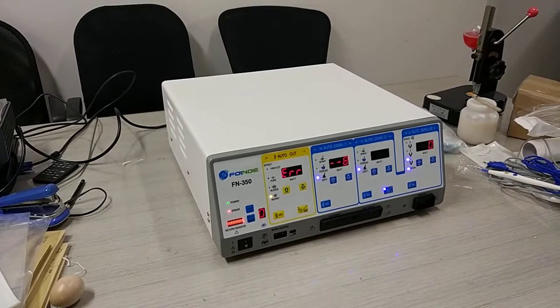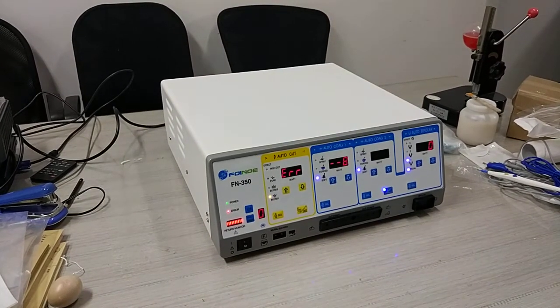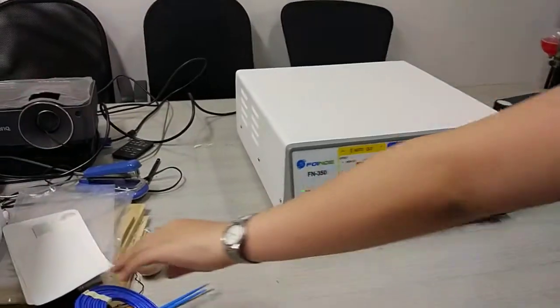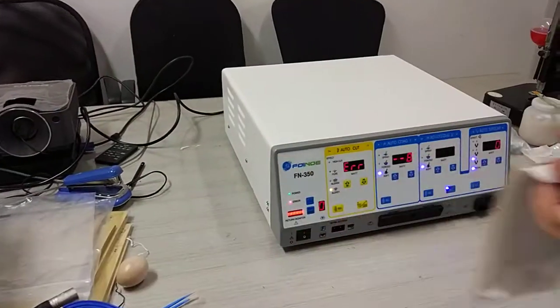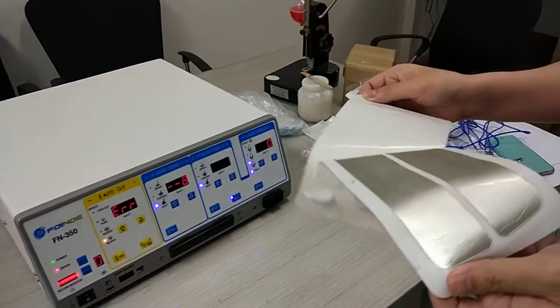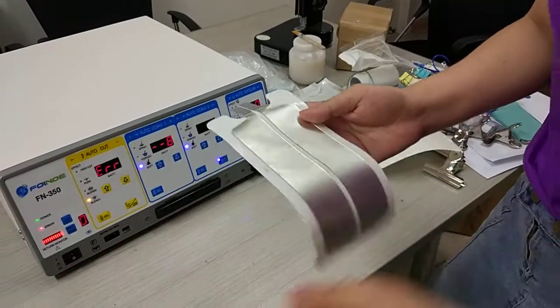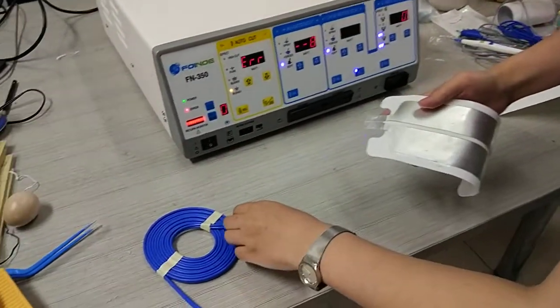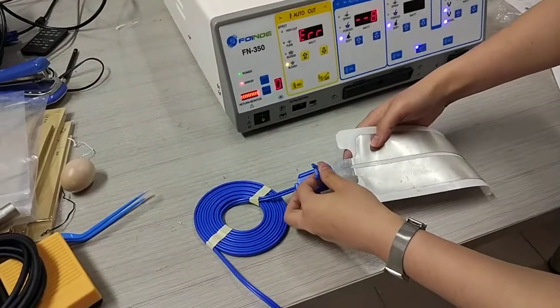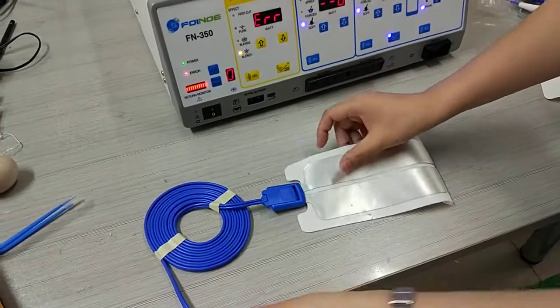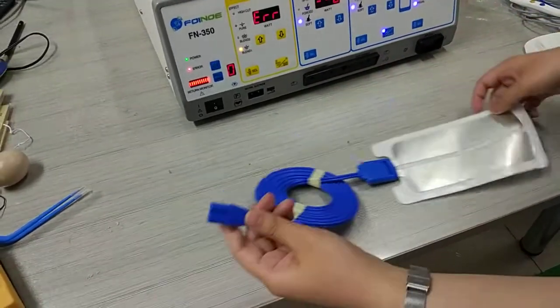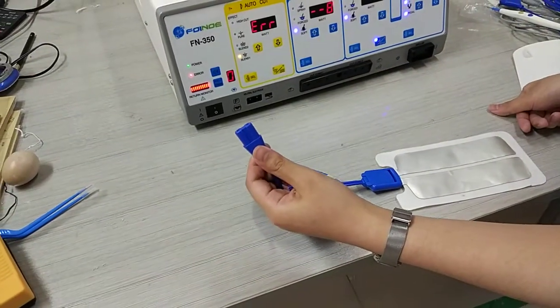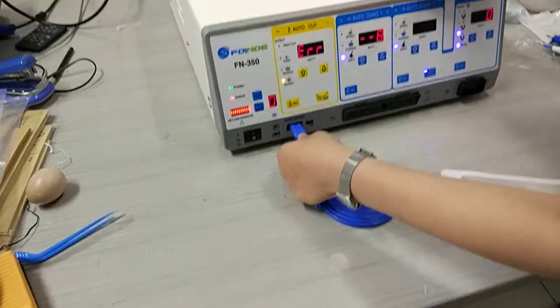We first try to connect the patient plate. This one. Push this cord to this port.